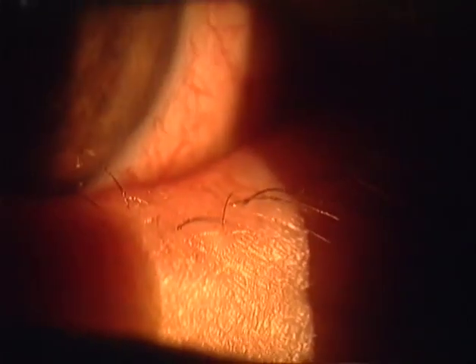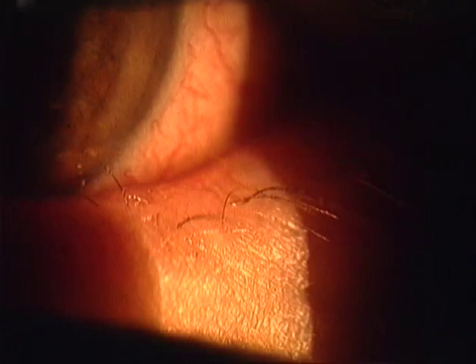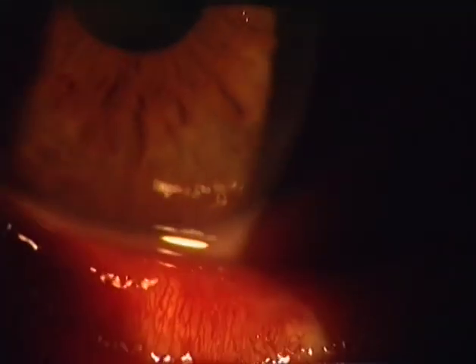Dislocated cilia are clinically relevant if they reach the inner edge. Here, the inward displacement of cilia has been caused by a dislocation of the entire ciliary row. Compare this with the normal position here, and here again, the dislocated row. The displacement has been caused by this contracting conjunctival scar.